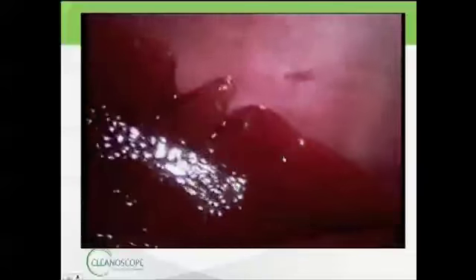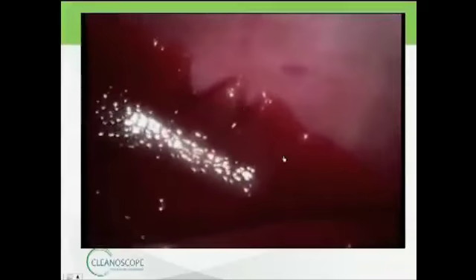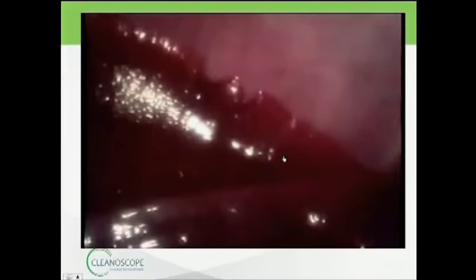Here's another, maybe a bit better, demonstration. This is touching the liver. Turned off, you'll see a smudge. Here's a smudge. They'll flip the switch. Now, clear. As for the motor on this thing, I'm not the inventor, he is here, and if somebody has some technical issues they want to discuss, it's over my head. But here you'll see smudge, clear. If you ran the disc all the time, you wouldn't see that, because it just stays clear.